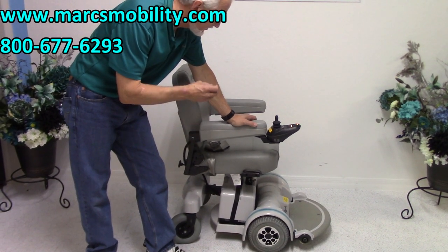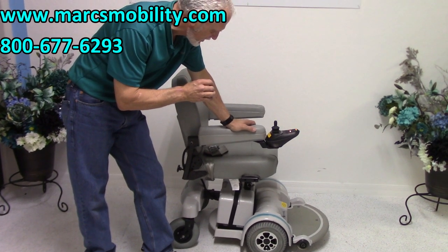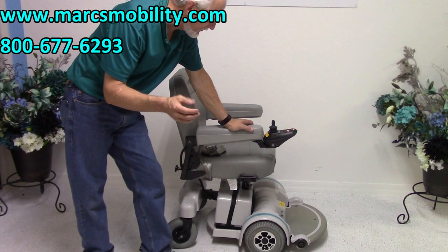As I said, it was used for about three or four months and it's practically brand new. It's an MPV5 Power Chair — it's the only chair that's made here in the USA. As a matter of fact, it's made right here in Sarasota, Florida.